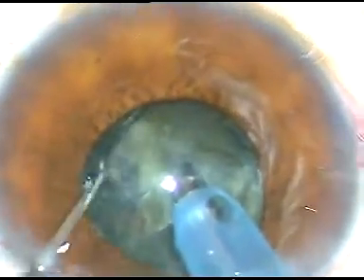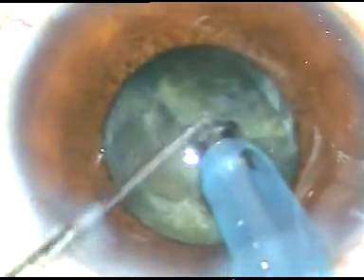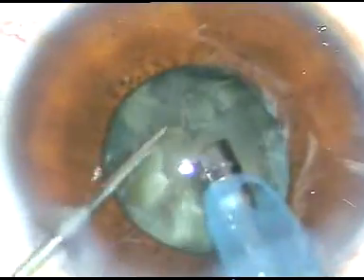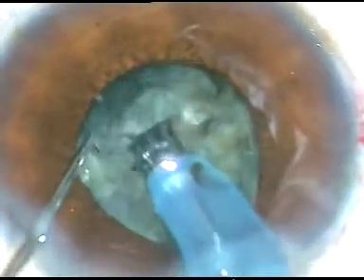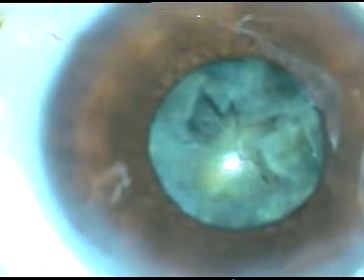So what to do when the pupil becomes so small? I have planned to chop the nucleus somehow and then see what I can do. I am making several chops. All the fragments are not free. Though this is a cataract which is not very hard, the fibres are interlacing and it appears a bit leathery. So what I do is I sculpt at the center and then come out. The pupil at this stage is quite small.